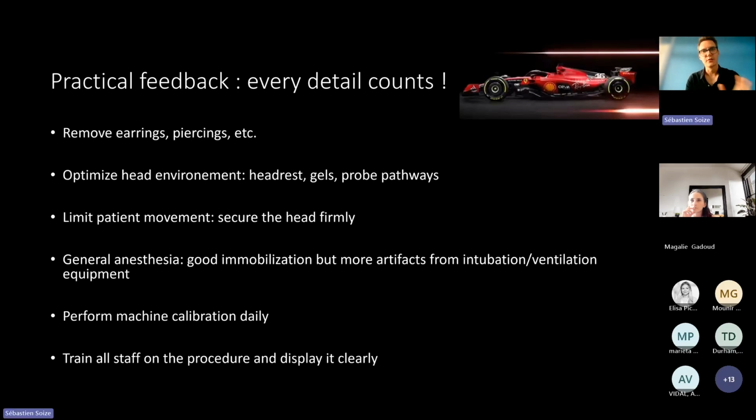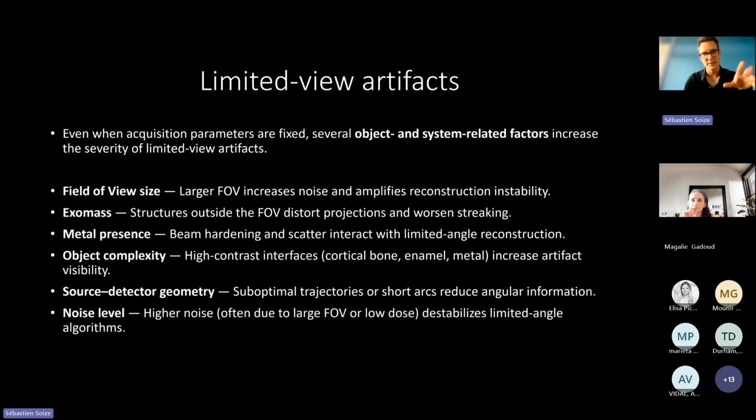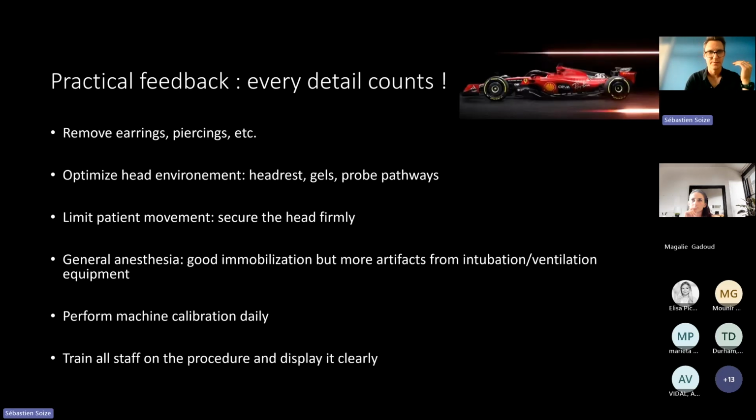So my practical feedback is that you have to be perfectly prepared to limit these artifacts. To limit these artifacts, actually we have a protocol and we are discussing with Philips to try to have two protocols, and one to reduce the field of view. So we can exclude directly the exomass, and also try to increase the mAs a little bit. Okay, so you increase the dose finally, but it can really help to overcome such artifacts.